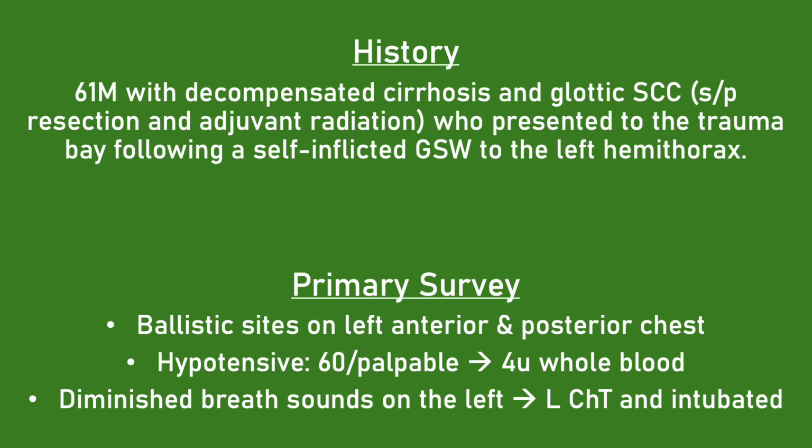So the history of this patient was a 61-year-old male with decompensated cirrhosis and glottic squamous cell carcinoma, which he had already had surgically resected and received adjuvant radiation. He presented to our trauma bay following a self-inflicted GSW to his left hemithorax. On primary trauma survey, he had ballistic sites on his left anterior and posterior chest.